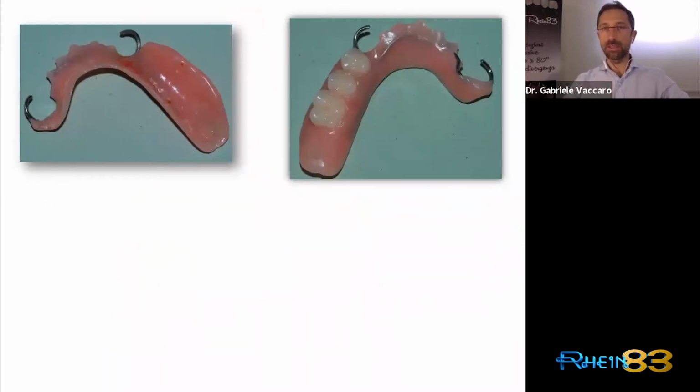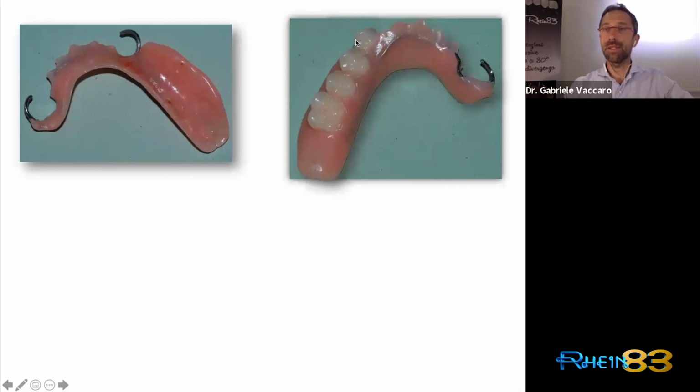So coming back to the clinical case, while we practiced the root canal therapy and placed the pivot, we gave the prosthesis to the lab. In the lab, they cut away the remaining clasp, the clamp, and added a new tooth.